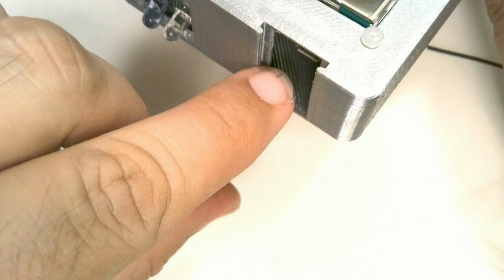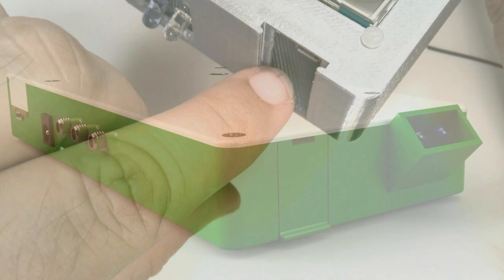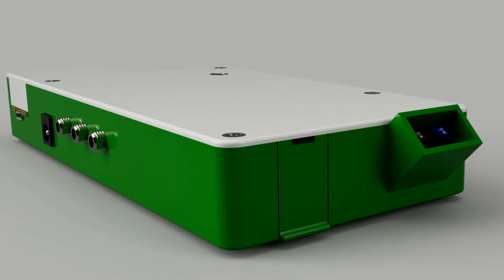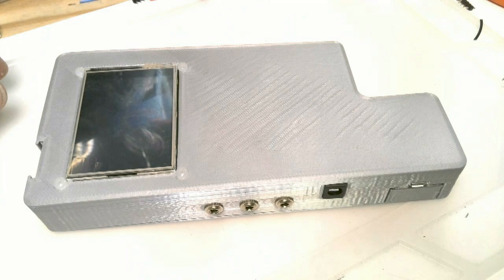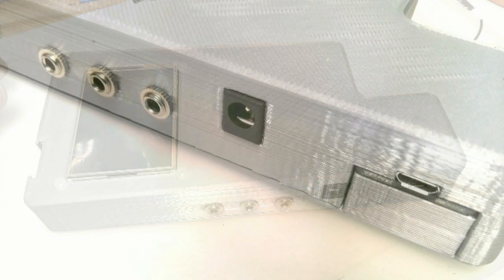There is a 3D printed door that slides into this slot and it covers the USB port, but you'll want to leave it out until you've finished programming the device. There is also an optional guard that you can glue around the LEDs to protect them. That completes the basic construction of the device. See the tutorial for how to upload software and customize it for your purposes.